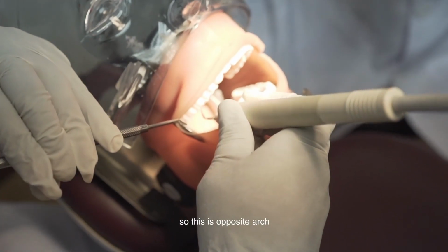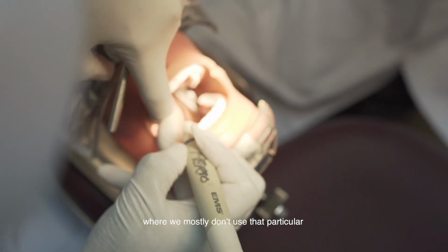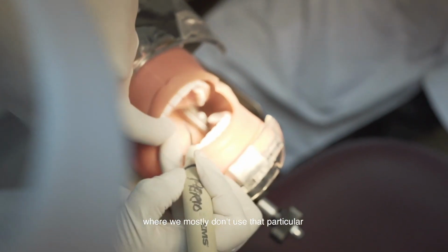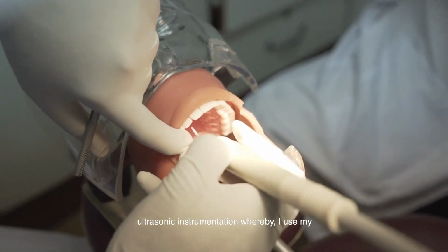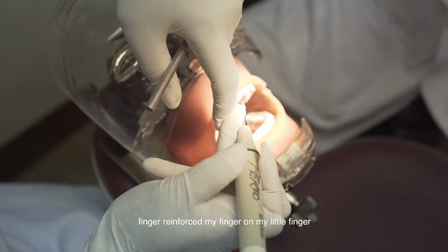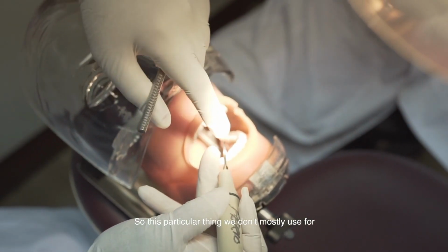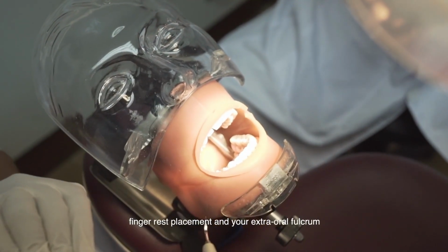So this is opposite arch. The last finger rest is called finger on finger rest, where I reinforce my finger on my little finger. We mostly don't use that particular finger rest for ultrasonic instrumentation. So this is about the finger rest placement and your extraoral fulcrum.